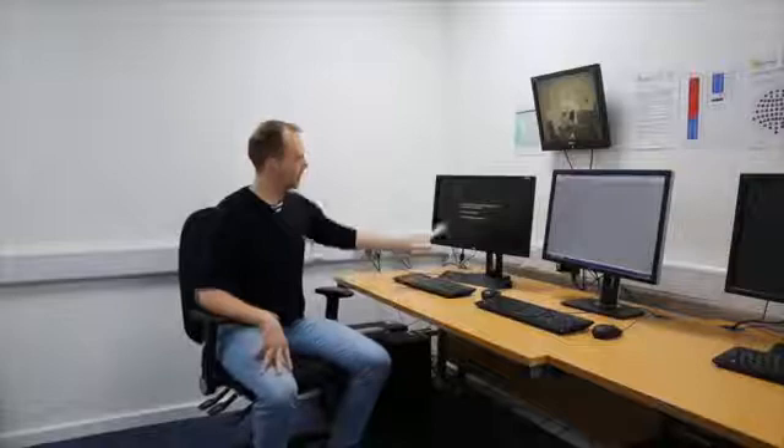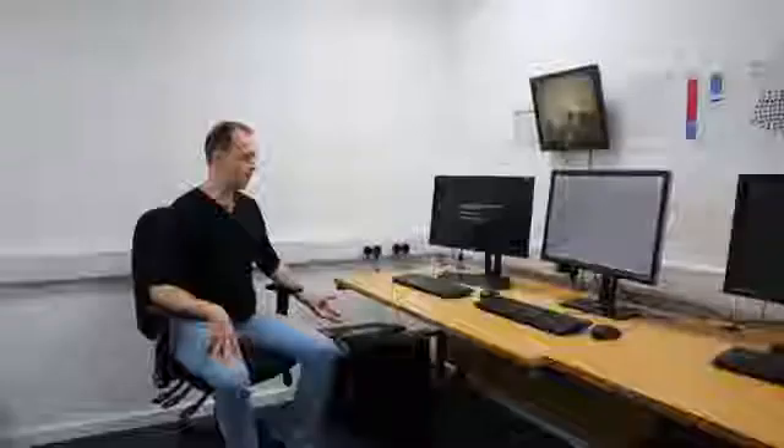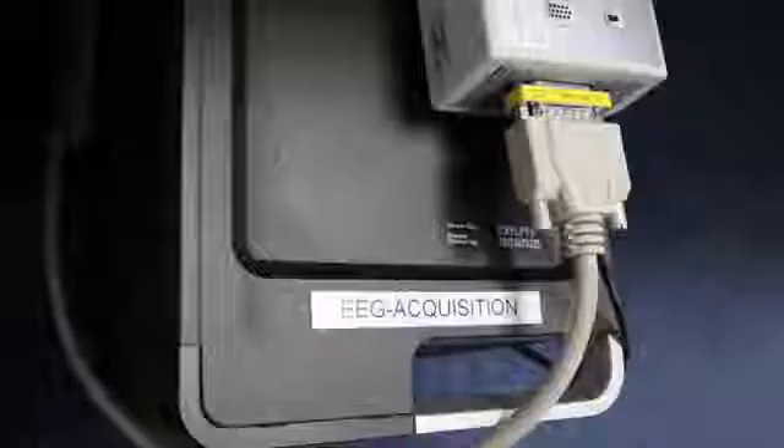Here we are in the control room. Usually there will be two computers: one on the left is used to present stimuli for the experiment to the participant, and the other is to record and visualize the EEG data coming in from the participant. Usually they'll be labeled — in this case one is labeled the stimulus PC and the other is labeled EEG acquisition. Identify which computer is which before you start the experiment.